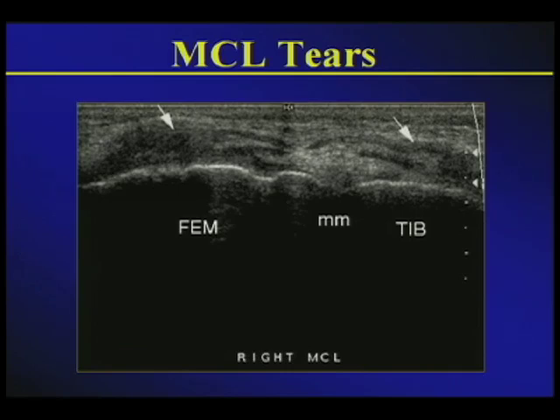Because these are wide sheets, they actually tear in a zigzag fashion. Note here the bone acoustic landmark of the femoral condyle and the tibial condyle separated at the joint line. Where you're expecting a trilaminar structure, now you have hypoechoic disruption at the femoral level and that of the tibial level. Of course, relatively preserved in the center, you could see some slackening of a trilaminar structure. That's because medial collateral ligament tears like to zigzag.